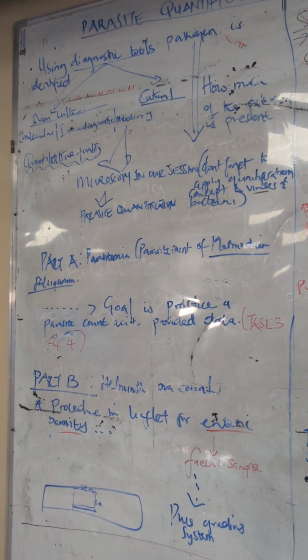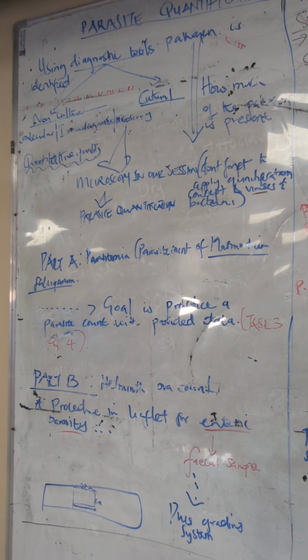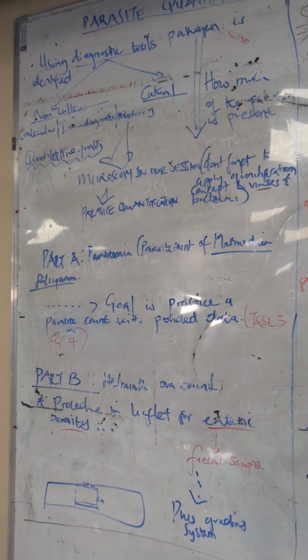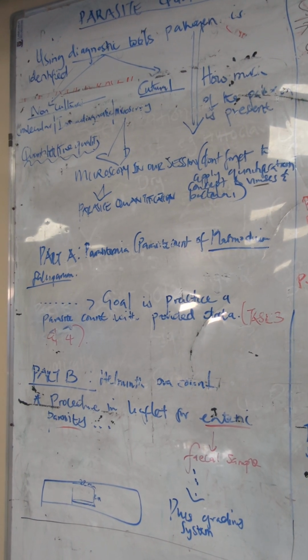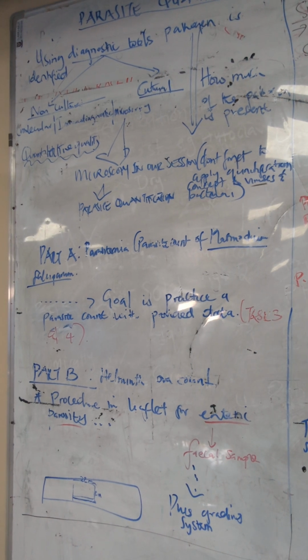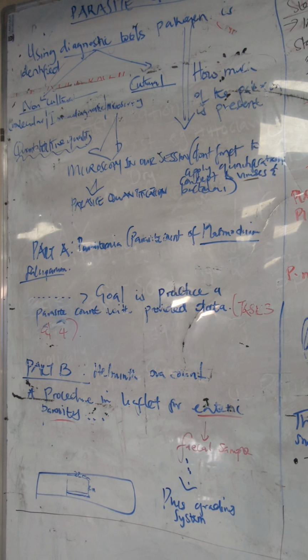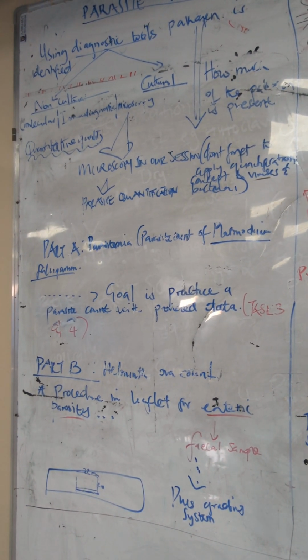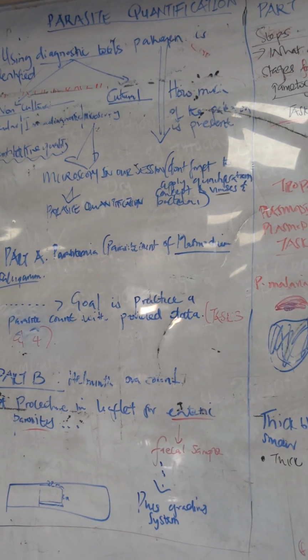Whether it was under the non-cultural molecular immunodiagnostic tools, microscopy, or on the cultural side, these are all working together to identify your viruses, your bacterial infection, your parasitic infections. But of course, in the limited lab here, we only appreciated microscopy and the immunodiagnostic tool, the RDT, the serology test. So with that said, we learned about the tools.